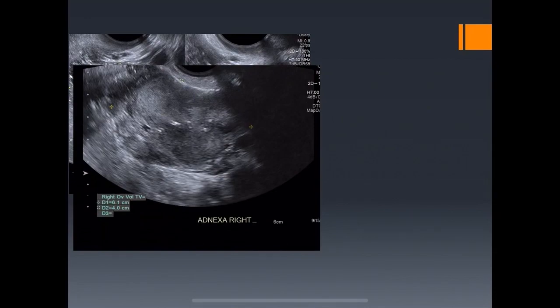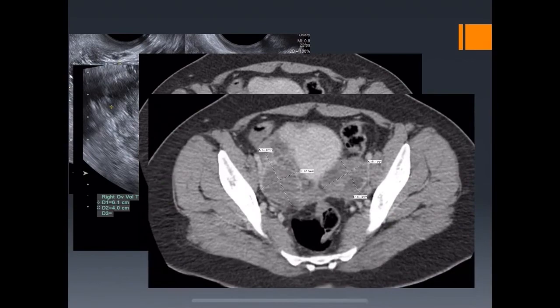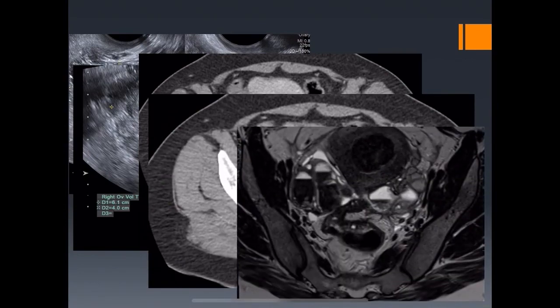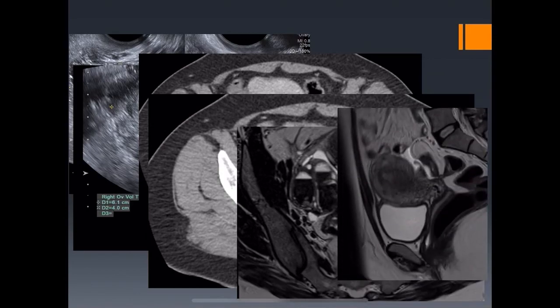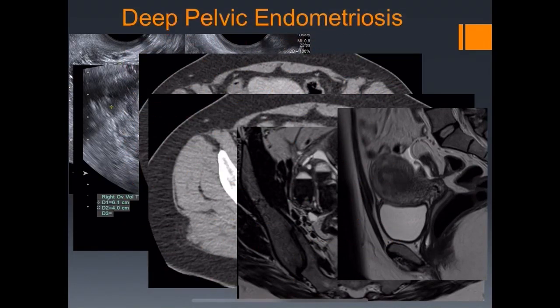A corollary case with pelvic pain showed large, complex-looking masses bilaterally on ultrasound and CT. We considered bilateral ovarian abscesses or malignancy. The patient got an MRI, which revealed multiple fluid-hematocrit levels consistent with endometriosis. On sagittal MRI imaging, tethering along the ligaments confirmed deep pelvic endometriosis. This illustrates that similar appearances on CT can lead to different diagnoses.